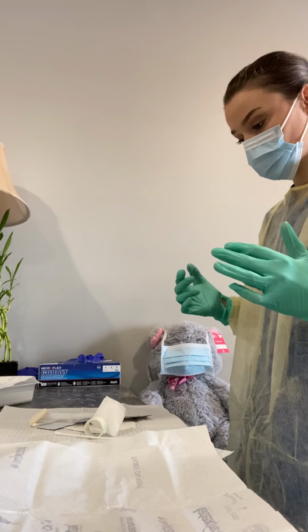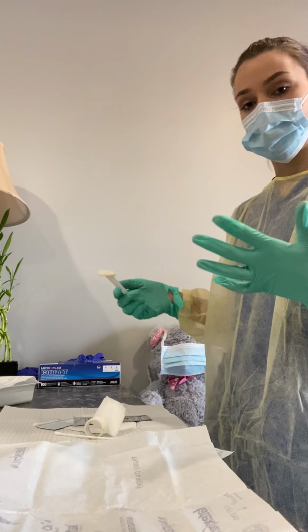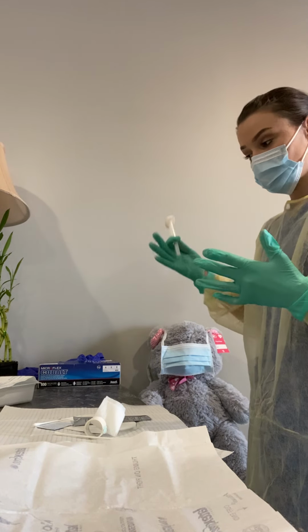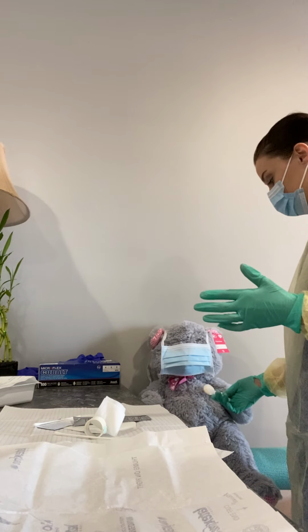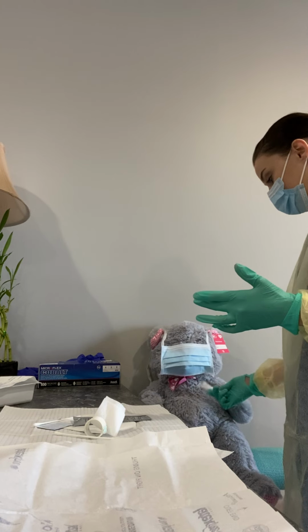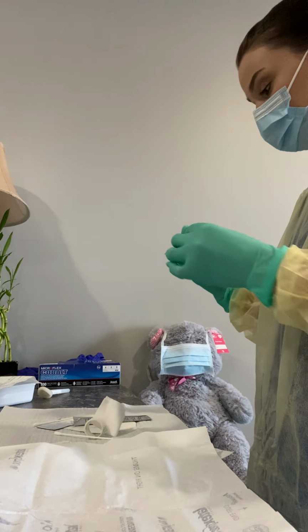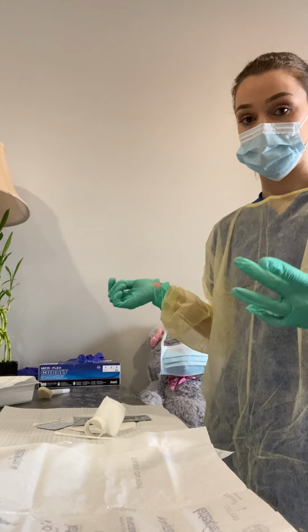Okay, so first I'm going to take my ChloraPrep, and I'm going to clean my patient's site from in to out. I'm going to clean over the catheter tubing, make sure I scrub that really good. So let's just say we're cleaning from in to out. And then I'm going to make the area pretty big since that's where my Tegaderm is going. And then I'm going to discard that.